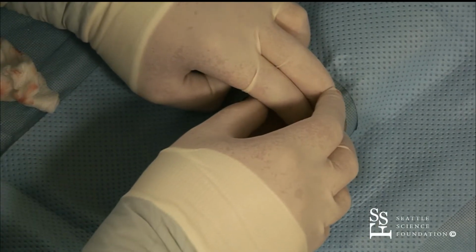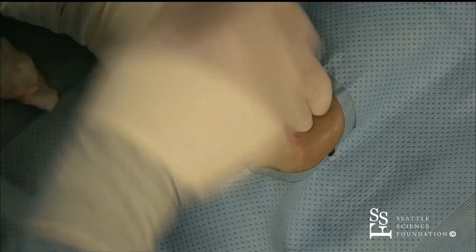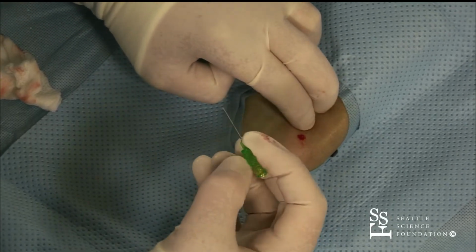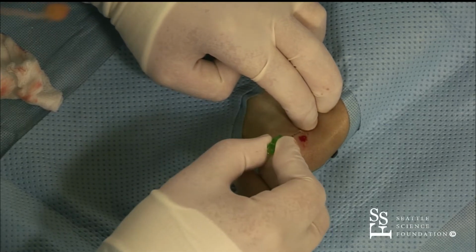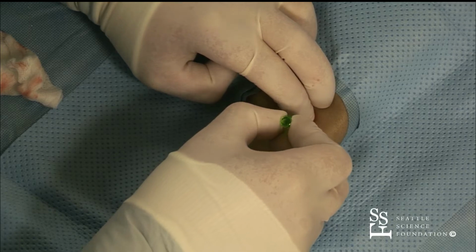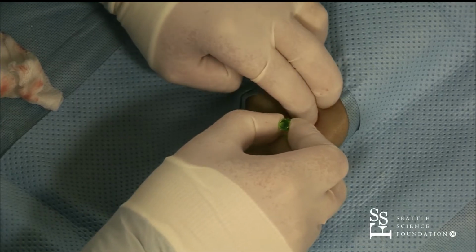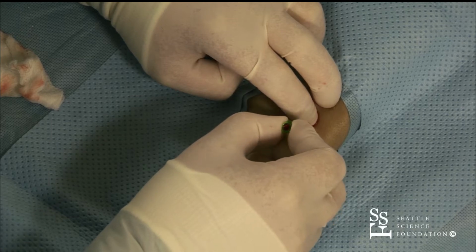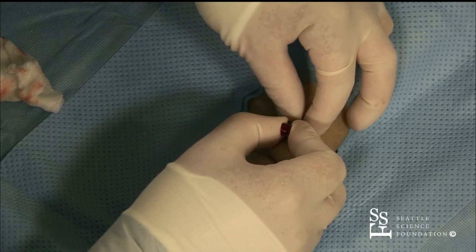So ultrasound-guided access is a must. It's not that you necessarily need to use it all the time, though a couple of us do use it all the time. I don't, but Steve Goldberg, who unfortunately couldn't be at this course, really loves sonosite, and he teaches fellows all the time, and it really works well for him. And it makes a lot of sense.